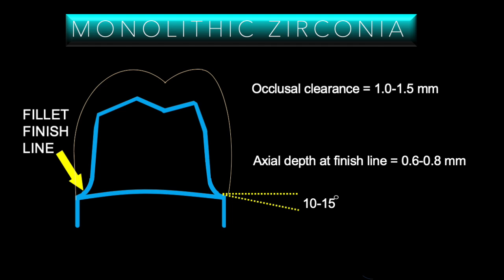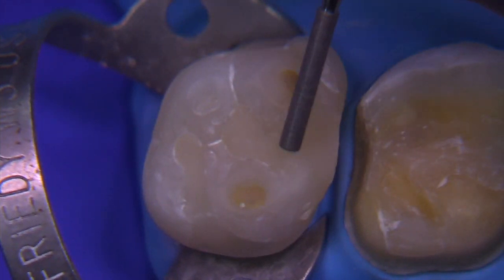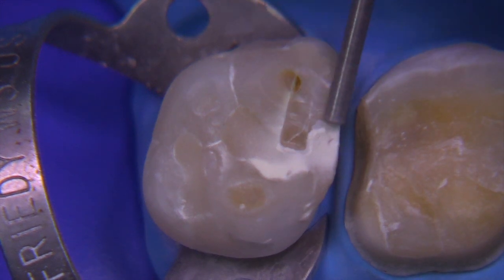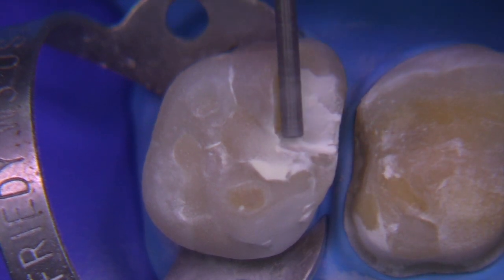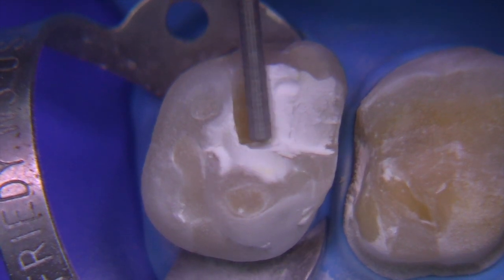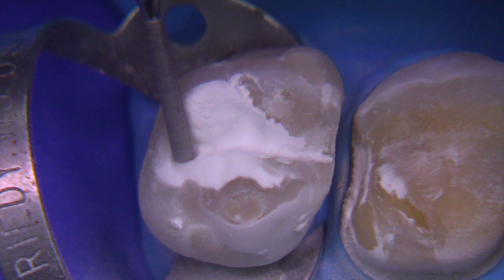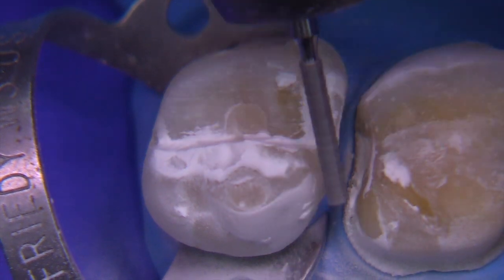Any less than 0.6 millimeters violates several principles with respect to zirconia and leads to fracture at the margins. So we're going to make sure it's beefy enough. One thing you can do is use a burr like this 837, which has a 1.2 millimeter diameter — that falls right between the 1 and 1.5 millimeters we need for occlusal clearance for zirconia. Now if this were e.max, we want to go more 1.5 to 2 millimeters, and that's with a preparation that's primarily on dentin.